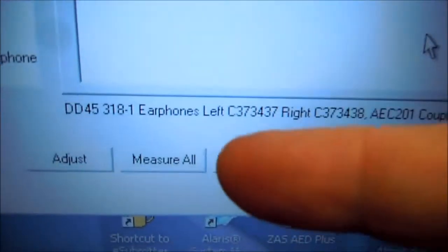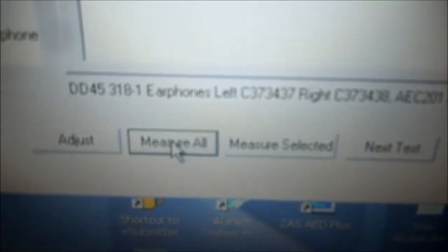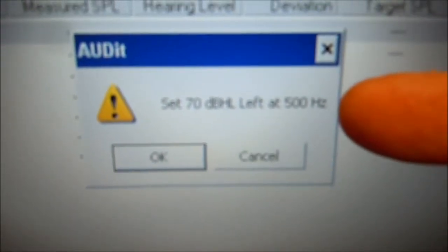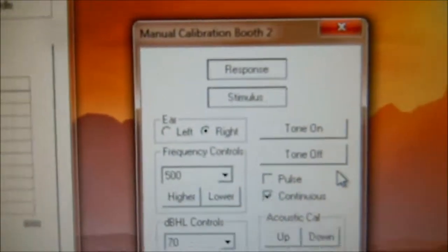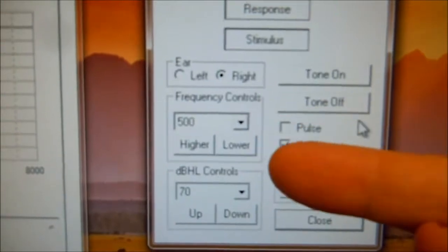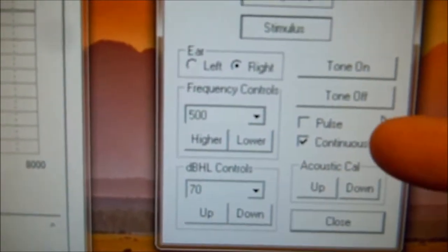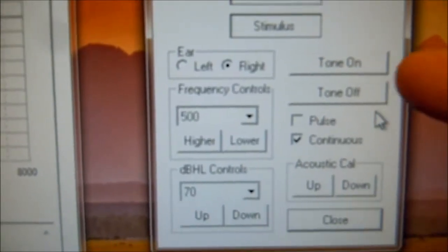Next, we're going to select 'Measure All.' The pop-up box pops up that says set the audiometer to 70 dB at 500 Hz. We go over here, we set our frequency to 500 Hz, our dB to 70. We make sure that only the continuous tone is checked.